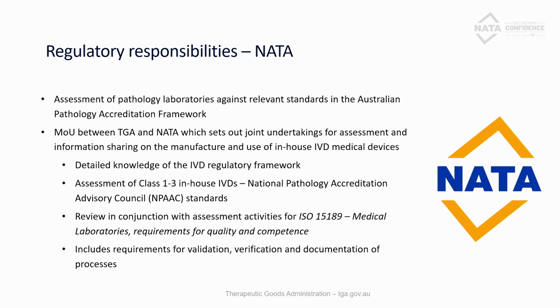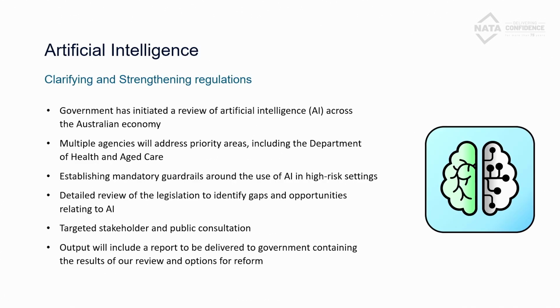Things to emphasise here is that the NATA assessors really have a detailed knowledge of the IVD regulatory framework the TGA oversees. They undertake their assessment in conjunction with the 15189 assessment and the accreditation, and also emphasise that the laboratory has those responsibilities around the requirement for the validation, the verification and the documentation for those IVDs that they are using.